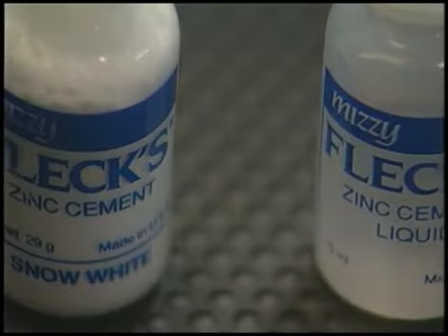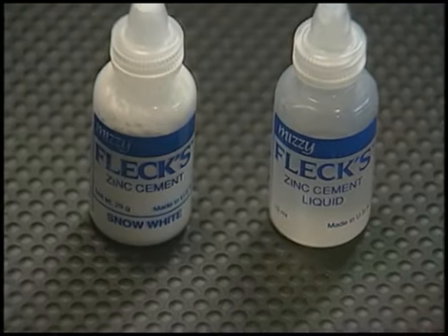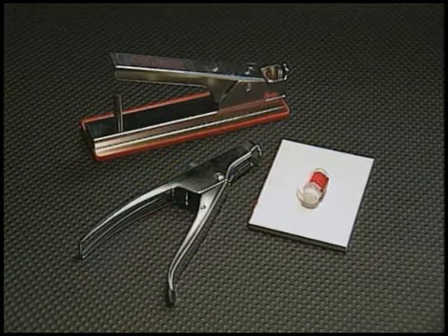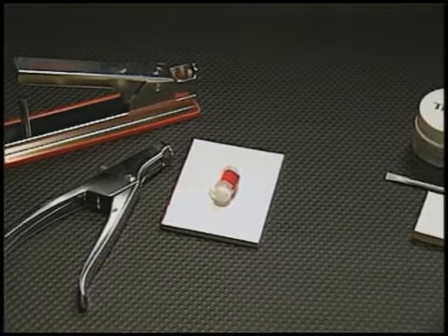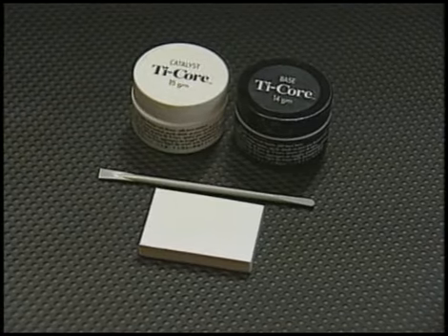Another factor that will influence safe and successful post retrieval is the cementing agents. Historically, posts were cemented with classic cements such as zinc phosphate, Durelon, or epoxies. However, with the emergence of new adhesive materials such as composite resins and glass ionomers, posts are frequently bonded into root canals, substantially increasing the difficulty for safe and successful removal.